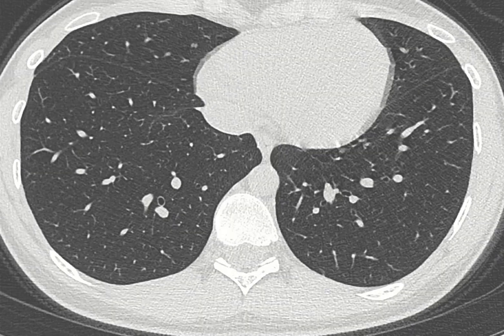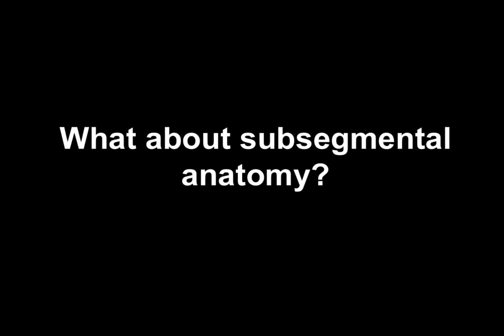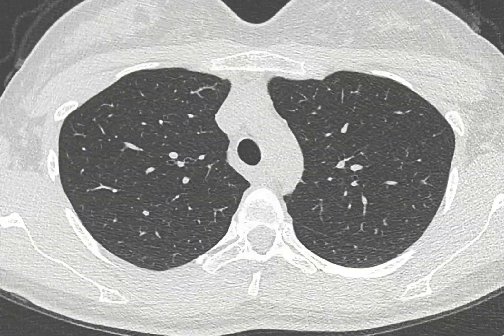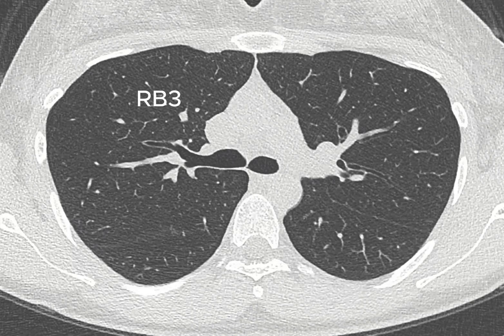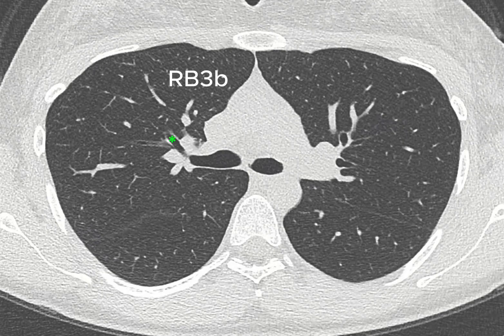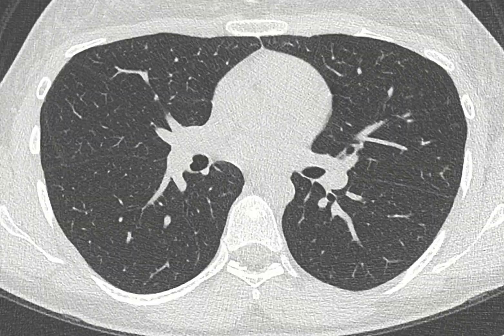Now we have seen all the segmental bronchi. You may wonder about subsegmental anatomy — sometimes you hear colleagues talking about RB3A and how to identify this on a CT scan. It's actually quite easy. For example, at the RB3 bifurcation, there is one branch in a more dorsal direction and one in a more anterior direction. The rule is that the dorsal one is the A and the ventral one is the B. This is the same on the left side — dorsal is A and ventral is B. That is practically all you need to know about subsegmental anatomy.